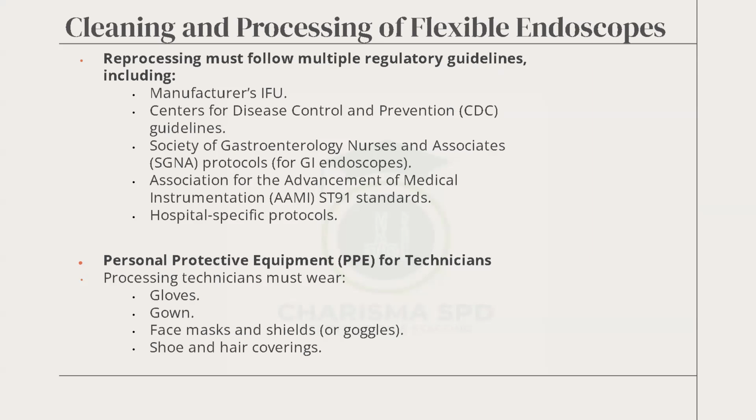Because it goes into your body, and some of them are not sterilized, they are only highly disinfected. It's just like using your wipes to wipe the top of your table. You cannot guarantee that it has touched every surface. Because of that, flexible endoscopes which deal with high-level disinfectant always have people coming back with infections of some sort. So you see the CDC coming in, you see the FDA coming in, you see some professional bodies making some suggestions to make sure that things are done right.